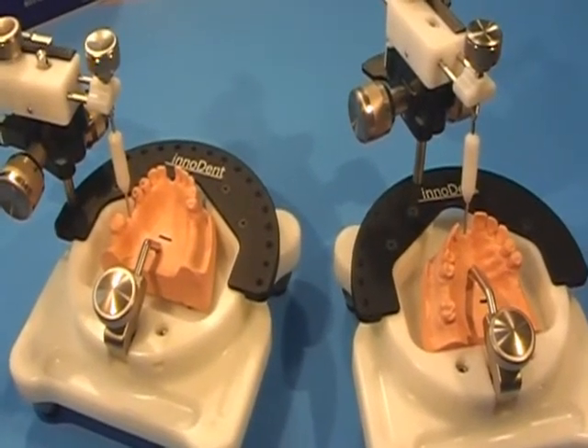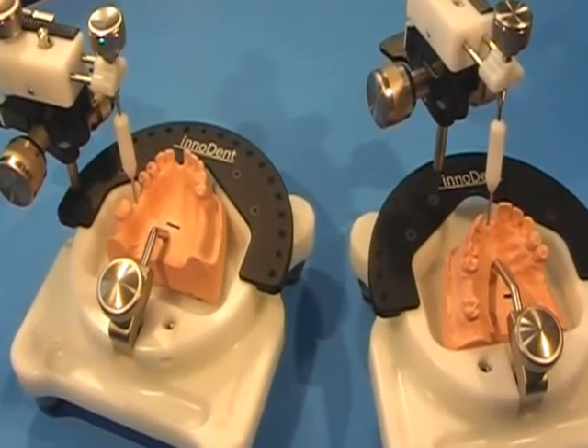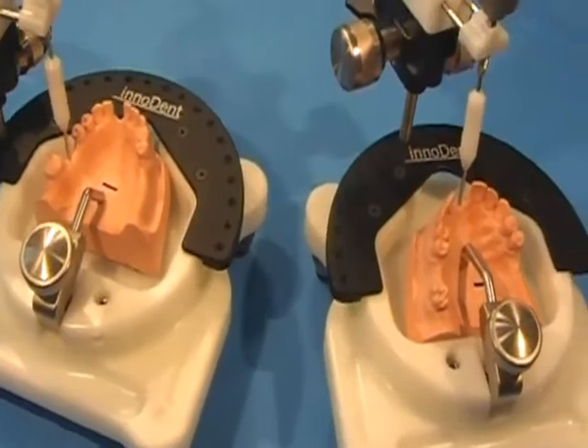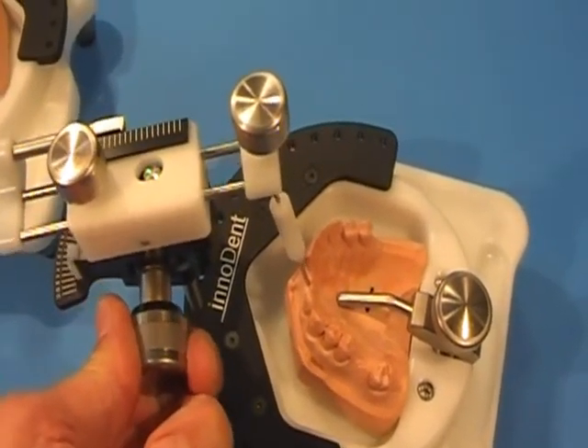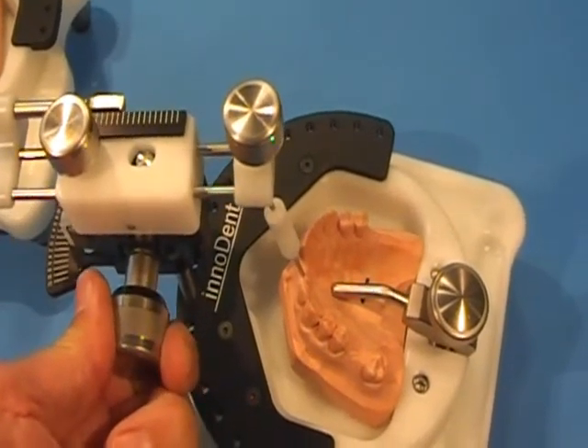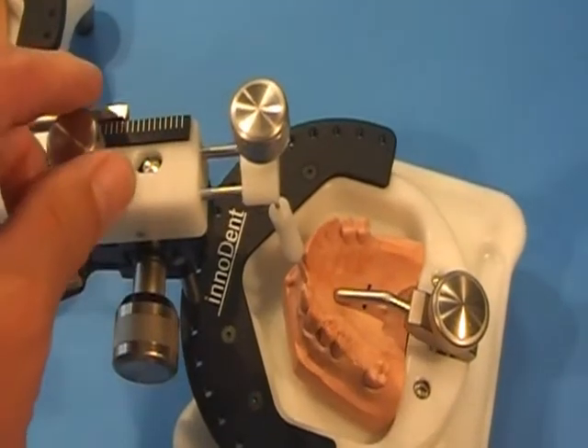It is also wonderful for tilting the model when doing anterior implants. Second, it is your personal assistant — it is going to hold your model. Third, it is going to help you visualize your drill path. And fourth, following cone beam imaging, if any adjustments are necessary, it is a precision calibration tool.